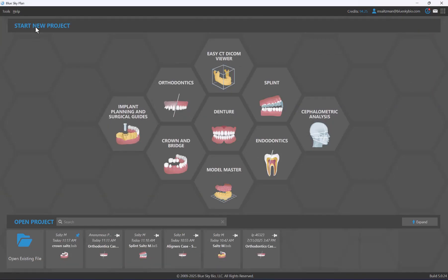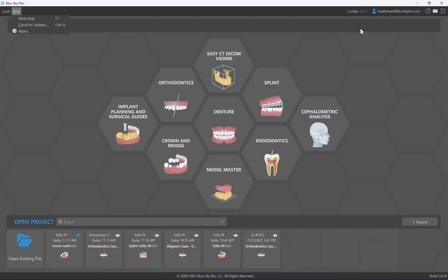Let's collapse the open project view. Before proceeding to start a new case, let's take a look at some other items on the screen — the top left has different menus to access preferences or help options.